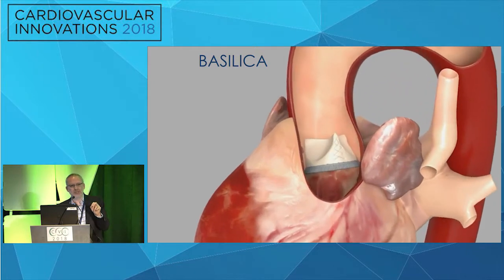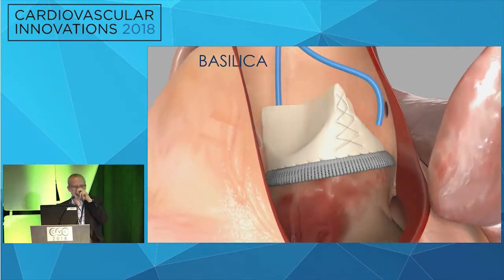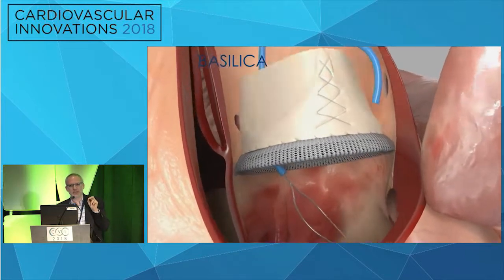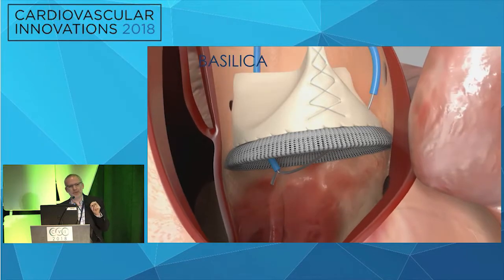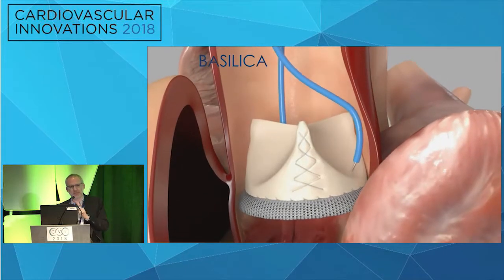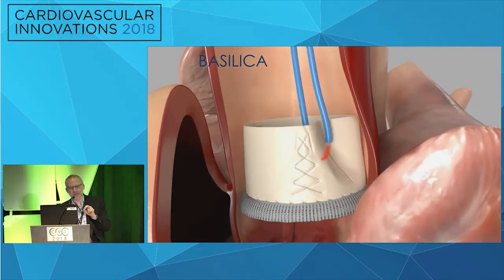So third point, innovation for optimizing TAVR. For those of you who don't know, BASILICA is a novel transcatheter technique to minimize the risk of coronary obstruction, developed by Jaffar Khan and Robert Lederman at the NIH, where we modified LAMPOON, which we were doing for mitral valves, to now split the leaflet of the cusp of the indwelling prosthetic valve or the native valve to get the leaflets out of the way.